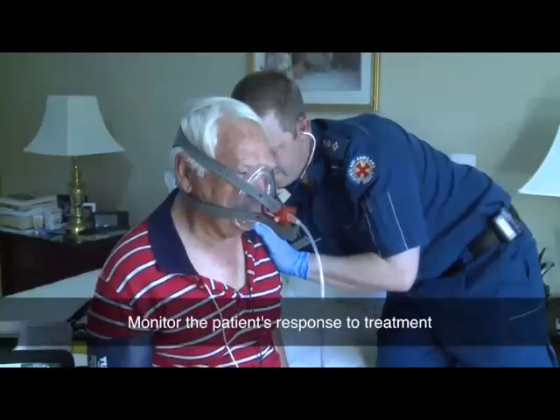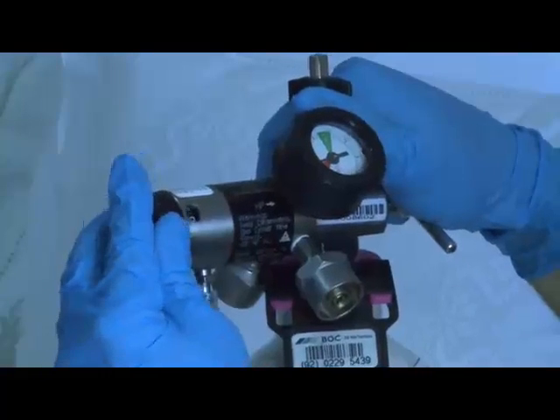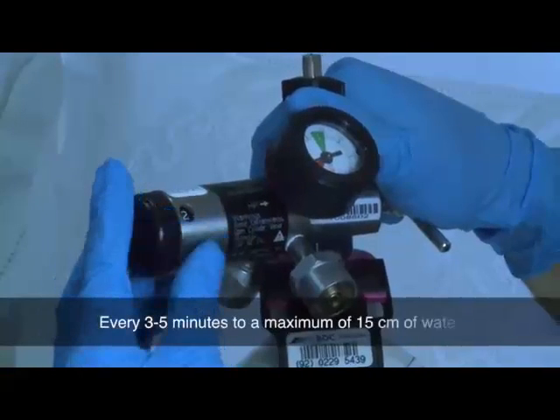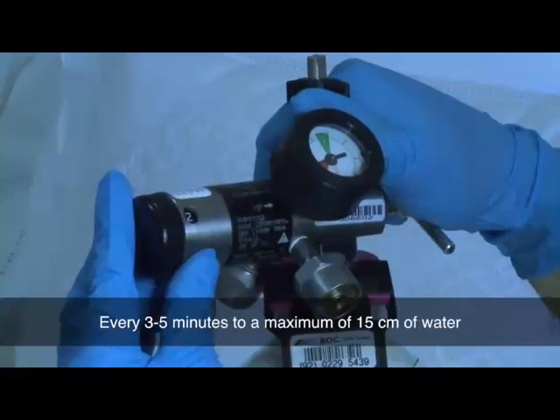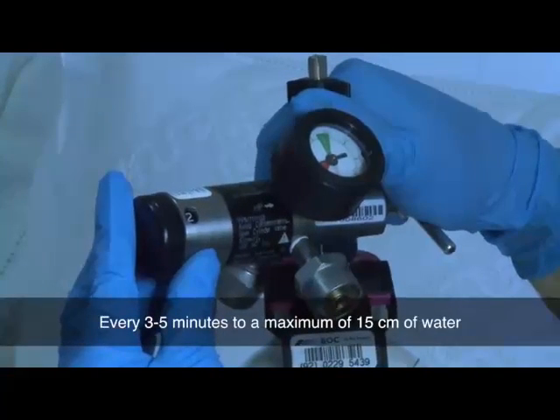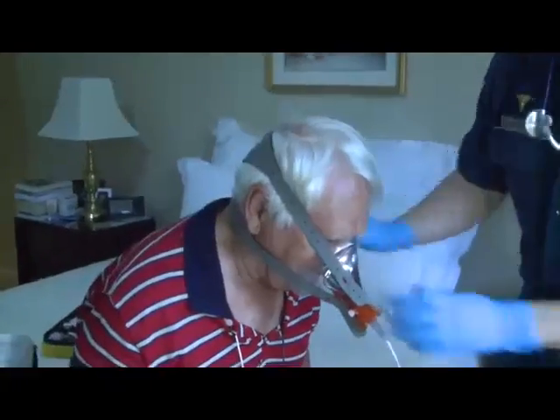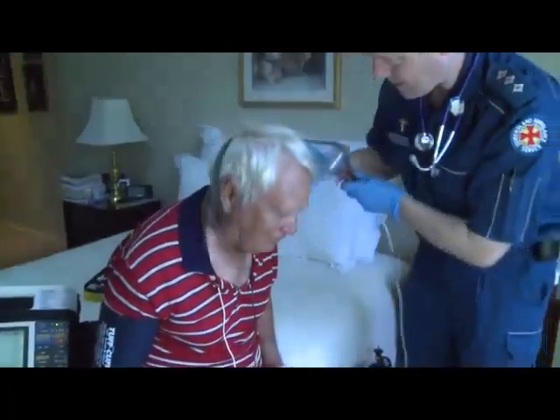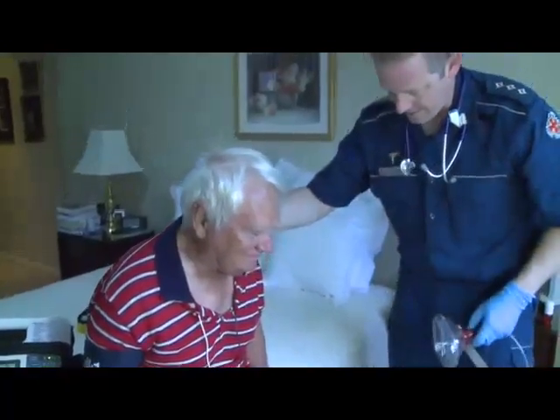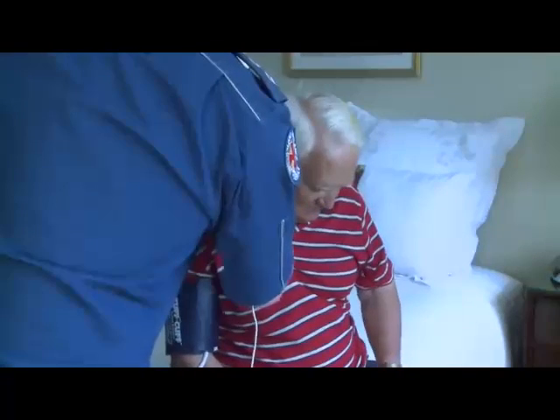If appropriate, increase the airway pressure every three to five minutes to a maximum of 15 centimetres of water. If the patient shows any evidence of deterioration or vomits within the CPAP mask, it is to be removed immediately and the patient treated in accordance with the appropriate CPG.